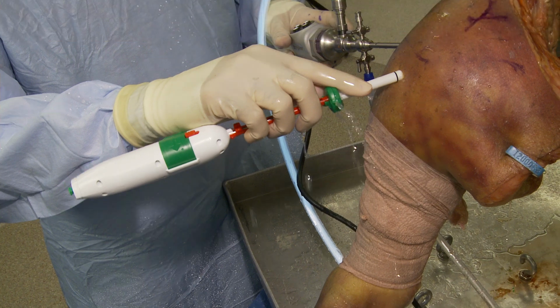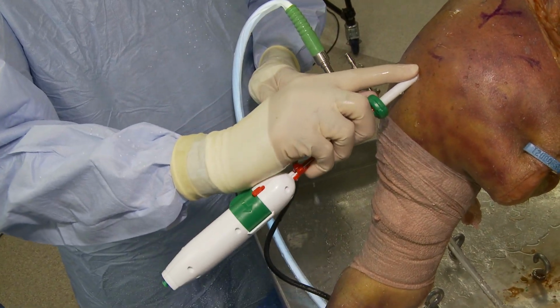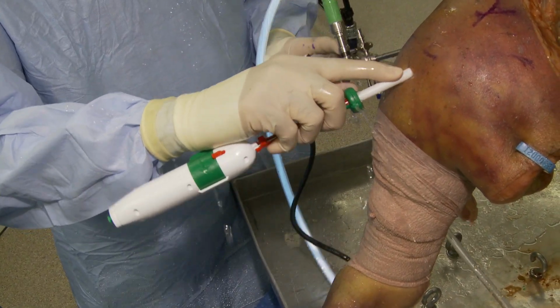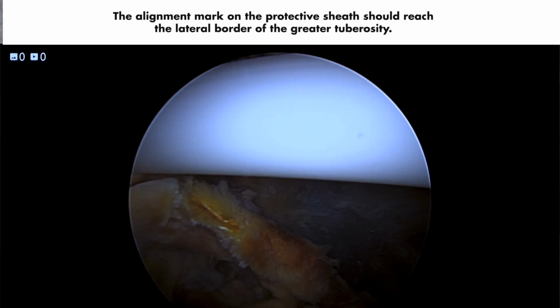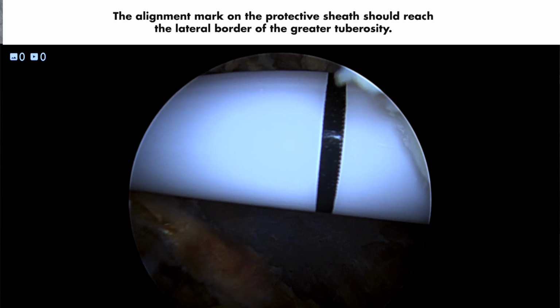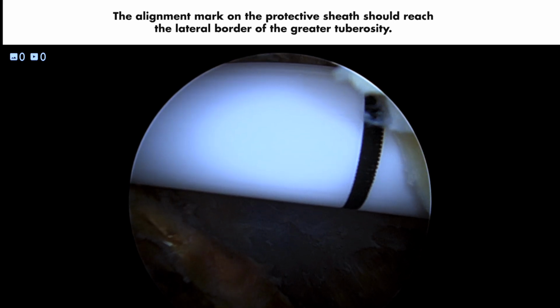You can see as I'm inserting the device, what I'm doing is keeping an eye on this alignment line that's present on the insertion sheath. I basically need to make sure that I'm visualizing that within my arthroscopic view within the subacromial space. And once I see that within the space, I know that the device is fully placed within the space and ready for deployment itself.